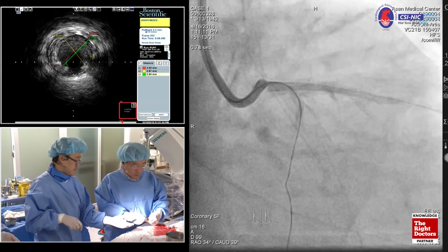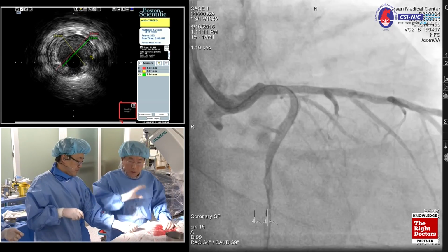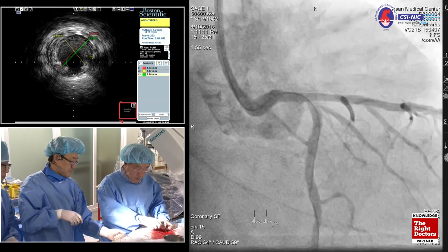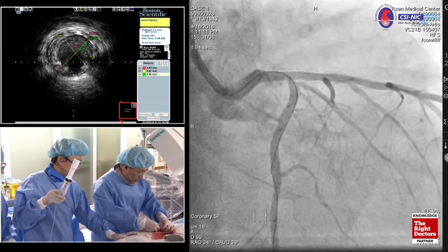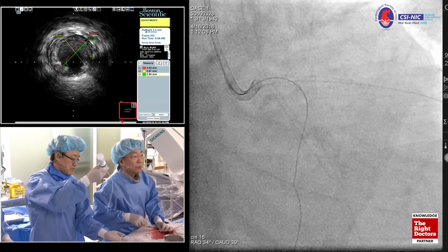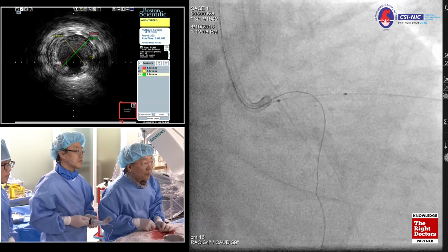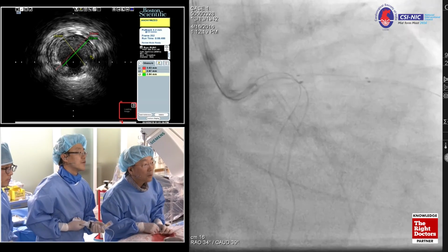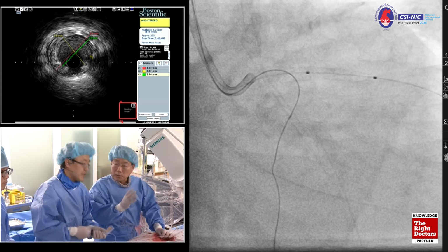We don't have data, but I believe we have clearer angiographic findings after breaking down the intimal hyperplasia of the ISR. Then we're going to do high pressure inflation based on the obvious findings. We have a lot of ideas, but maybe it's here. Judge the distal, right? Yes, right.